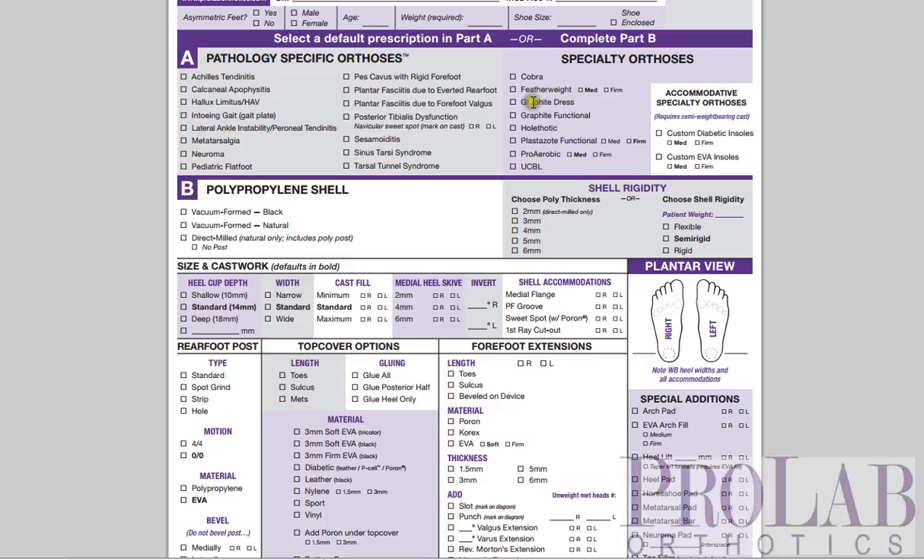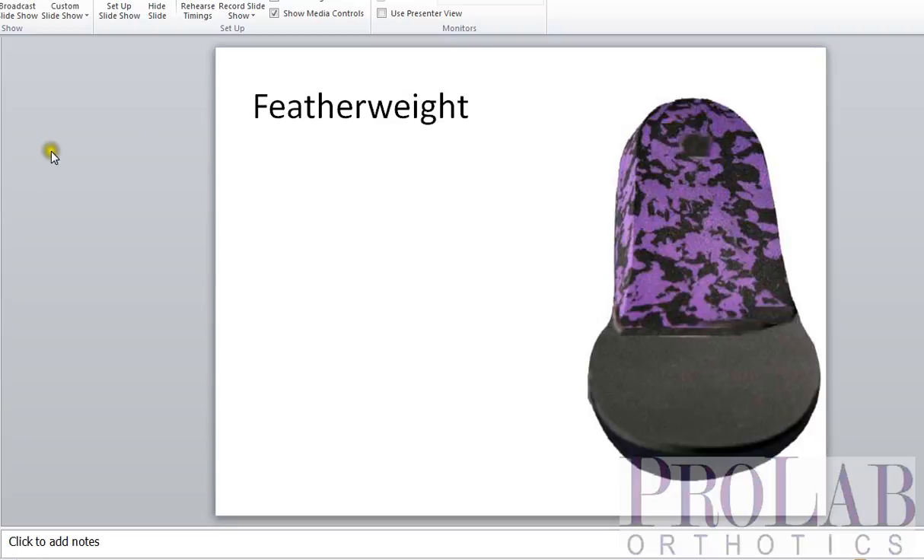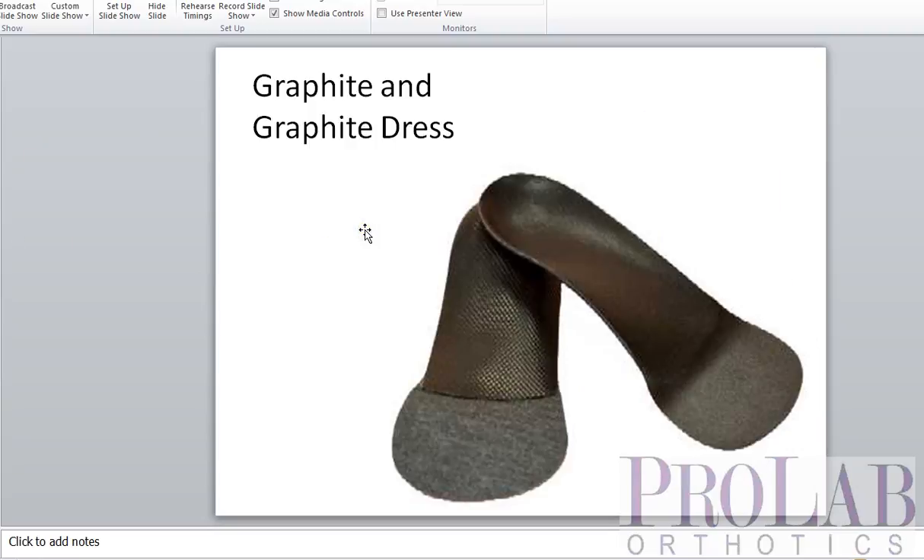The next devices are the Graphite Dress and the Graphite Functional. These are actually the same orthosis except in size. Graphite is an exceptionally thin material, great for dress flats for women, dress shoes for men, and sometimes used in soccer shoes.